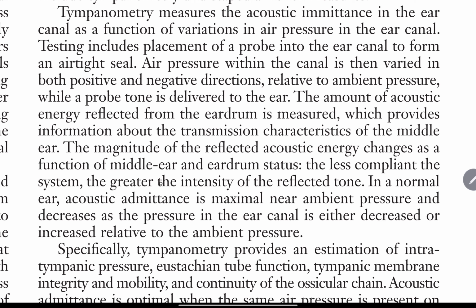Because the eustachian tube serves to ventilate the middle ear space, the tympanogram peak also provides information regarding eustachian tube function. A negative tympanogram pressure peak is almost invariably abnormal. It indicates that the eustachian tube is not adequately ventilating the middle ear space because of eustachian tube obstruction caused by inflammation, infection, a mass lesion, or neuromuscular dysfunction.